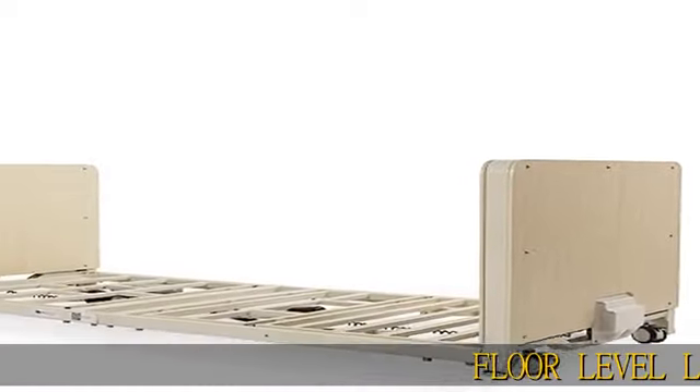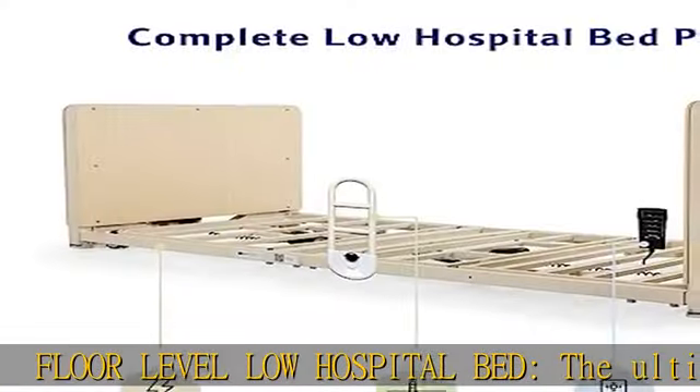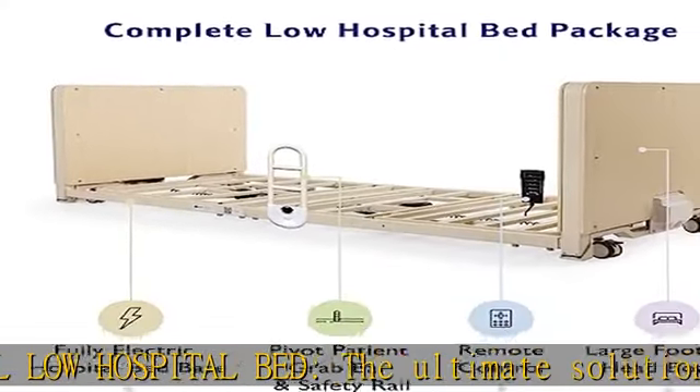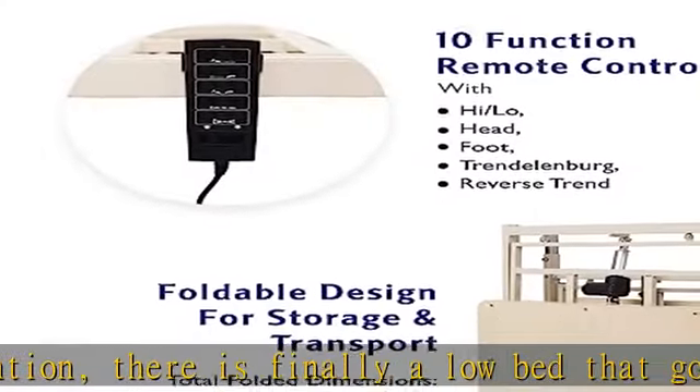Floor level low hospital bed — the ultimate solution for fall prevention. There is finally a low bed that goes down to as low as 3 inches and as high as 25 inches, with large head and foot boards. It is easy to assemble and is foldable to as narrow as 20 inches for compact storage.